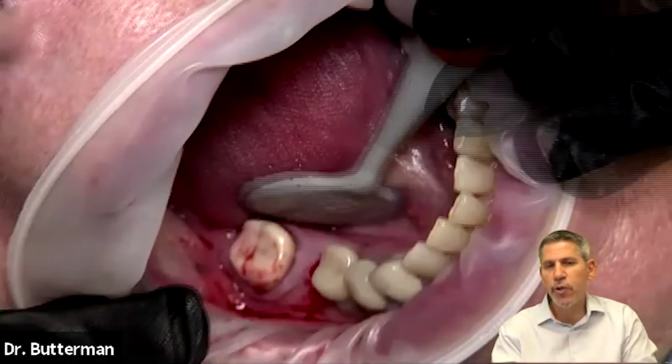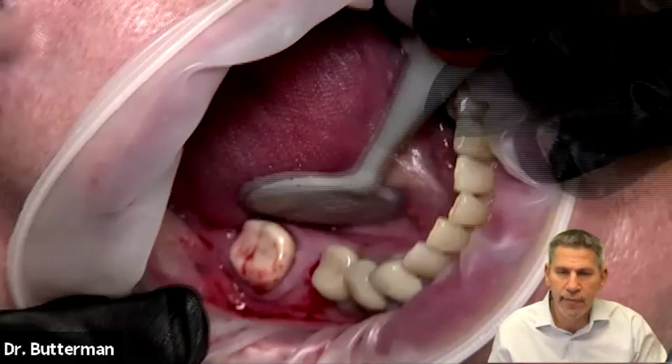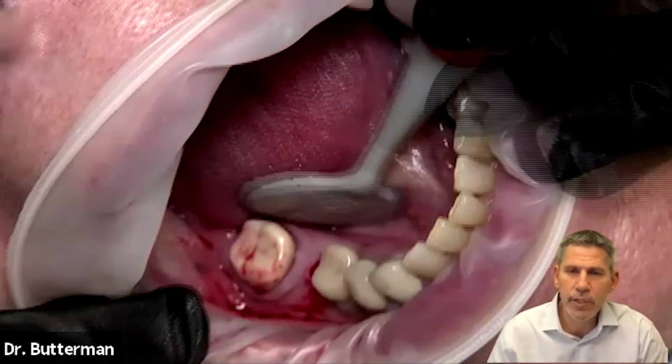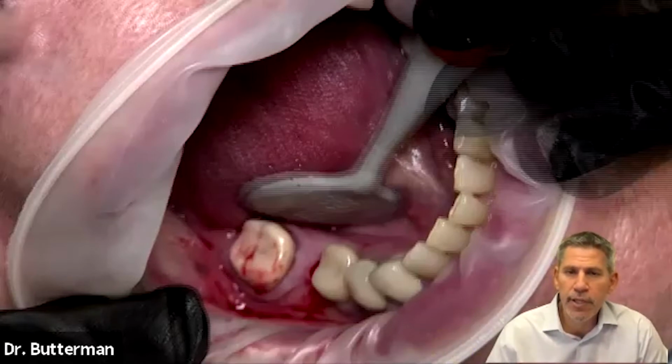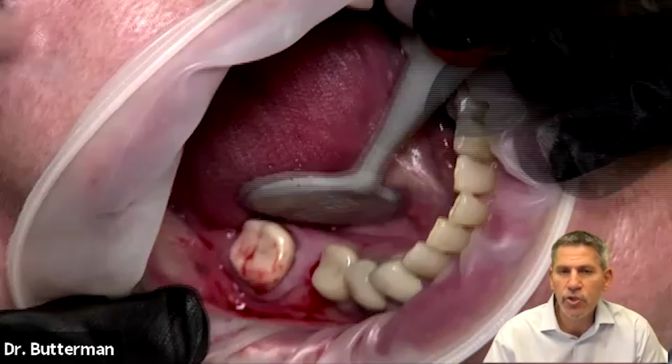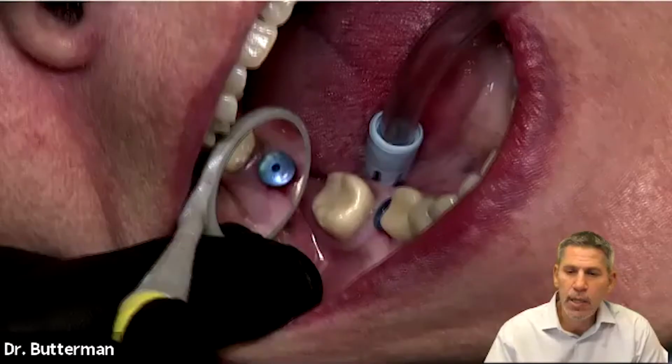So how many check films do I take during the surgery? Well, I don't take any check films during the surgery because I'm doing this guided and I've already planned everything. The implant can really only end up in one place if I've been accurate along the way. And really that's the benefit of having a really good Axeos scan, because now you have an image that is going to be very accurate. So my patient then leaves with a healing abutment.